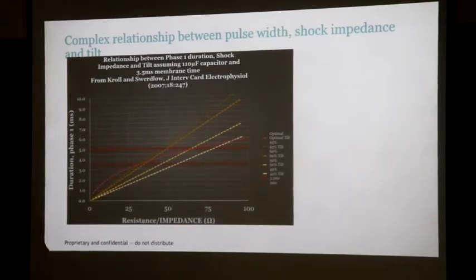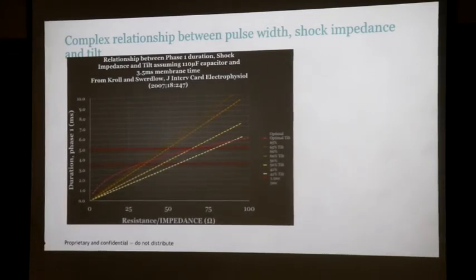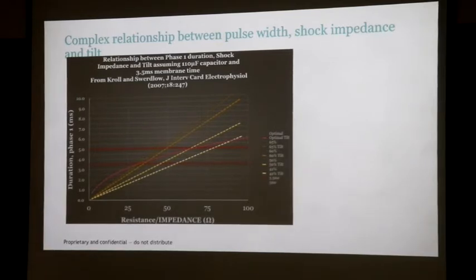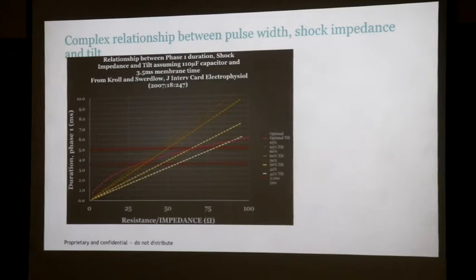So your energy goes down, but it's not about energy. This is about current. We quote energy all the time because it's easy, but it's nearly nonsense. It's current that defibrillates people, not energy. If I come in with a gun and you're in VF and I shoot you, I will not stop your VF, right? Or if I put a pacemaker into you, and I can get 30 joules out of a pacemaker, easy. But not the current.